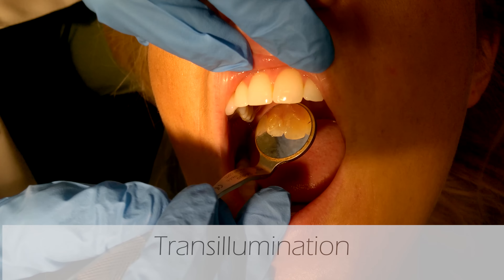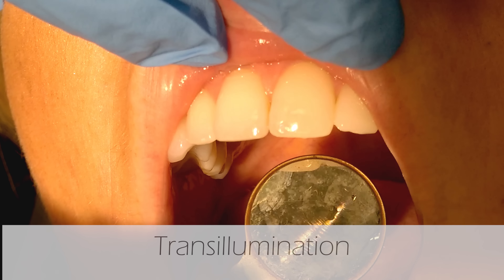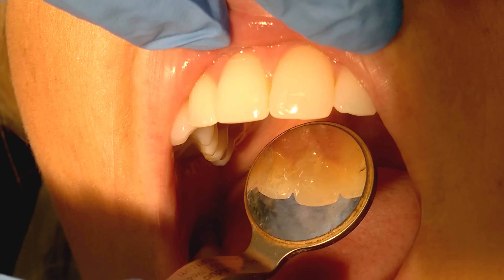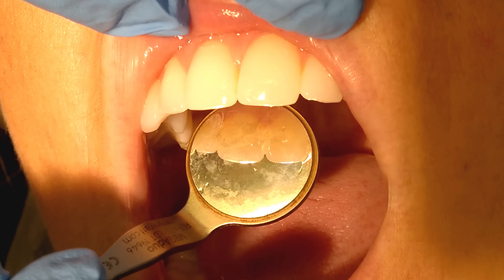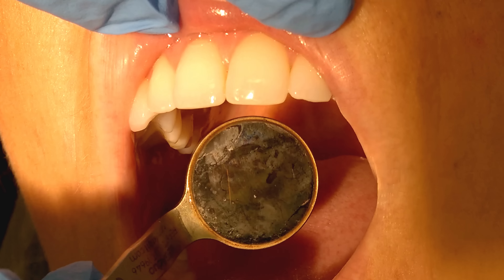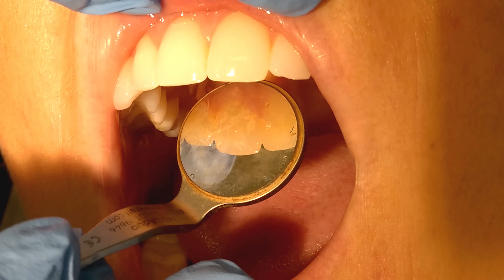The third use is transillumination. Sometimes dentists will use this to check for caries between the anterior teeth. What you do is shine the light directly behind teeth eight and nine, and it lights up the area. If there are caries, you'll see a discoloration near the contact.